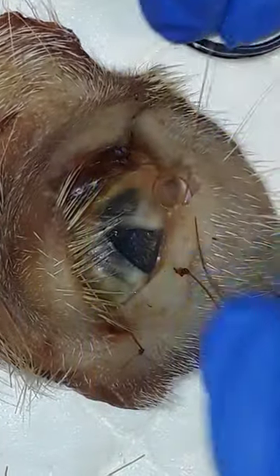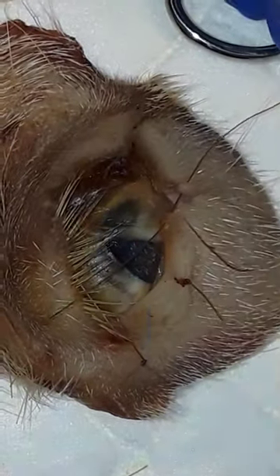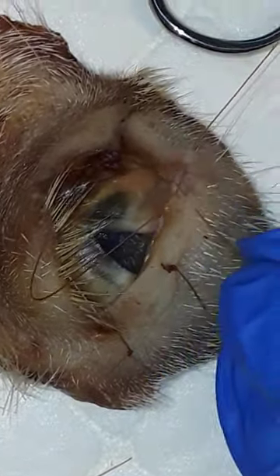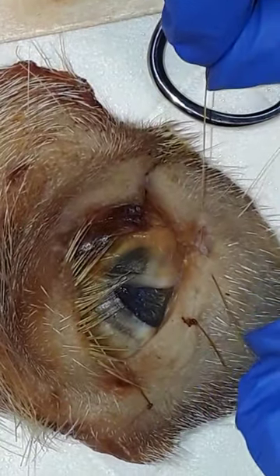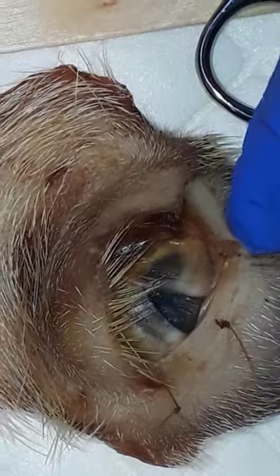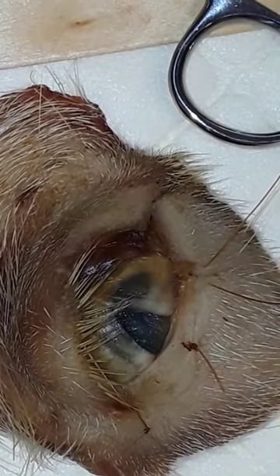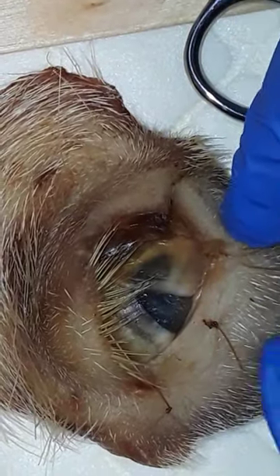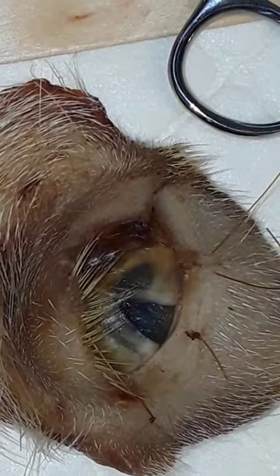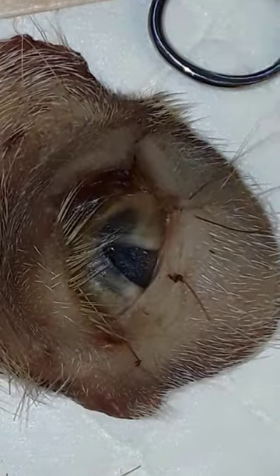Now I'm kind of in the shape of an eight — you can see how it's crossing over like that. If I gently pull on both sides it should nicely come together. We have the edge of our eyelids coming together with no defect or step, because I tried to stay as symmetrical as possible with my bites on either end. I can now go ahead and close this.